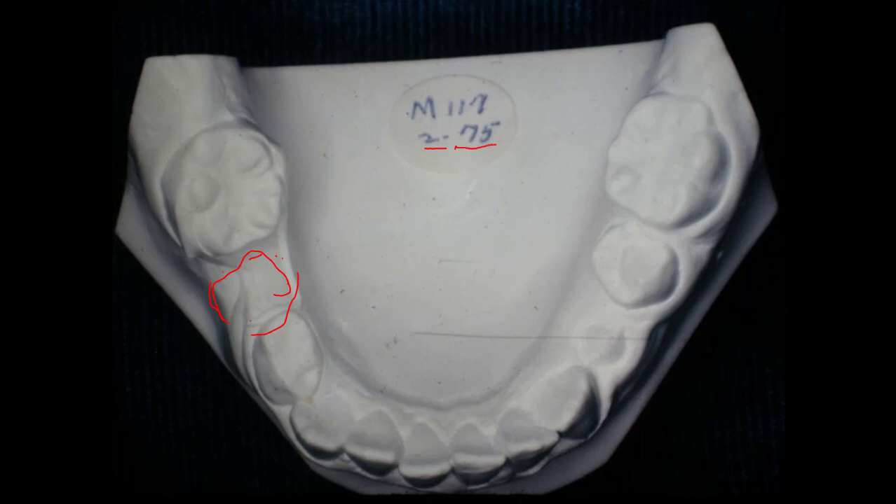This was in February of 1975 when I took these models. We didn't have brackets to start with — we just banded this case, and that made it a little harder to close the space. But we managed to pull the space together with a long, thin elastic, and it would close the space. People just chew everything — bubble gum or whatever they wanted.